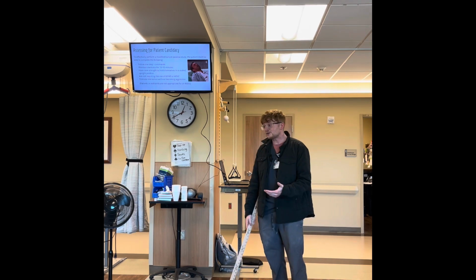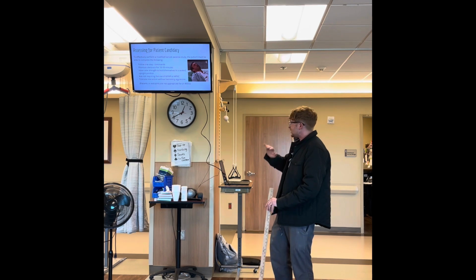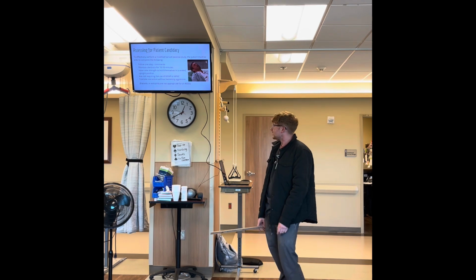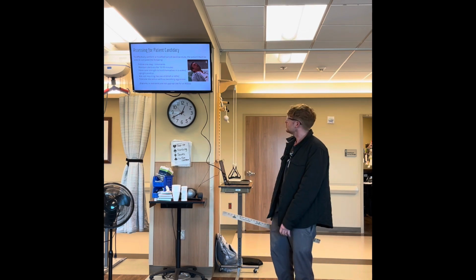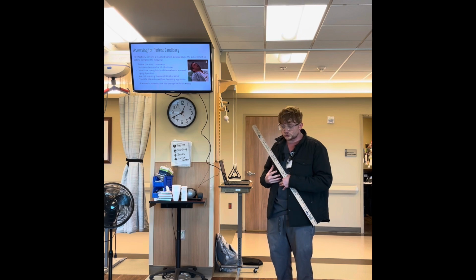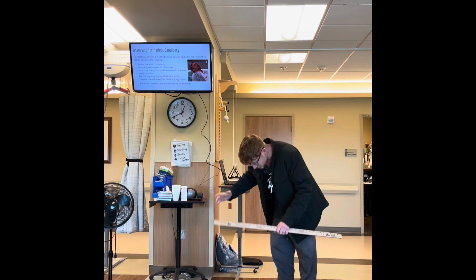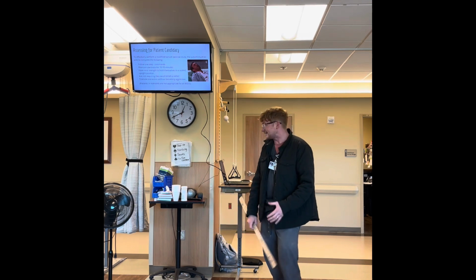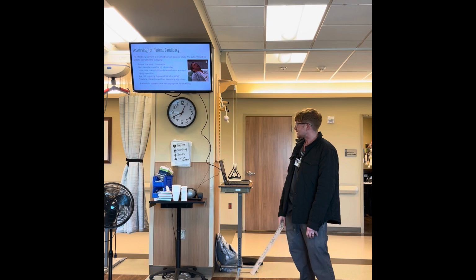I mean, if you have to cue them a little, it's not the end of the world, but you don't want them to really just be not able to participate. Maintain the alertness for 10 to 15 minutes. That's about how long we need from them. We want to look for core strength. There's a strap on the chair down there, but if they're really slouched over, that's not going to be a great position. So we really want them to be able to hold themselves up during the exam.